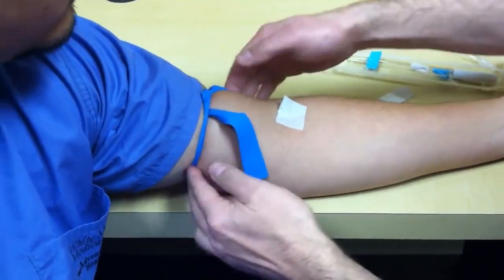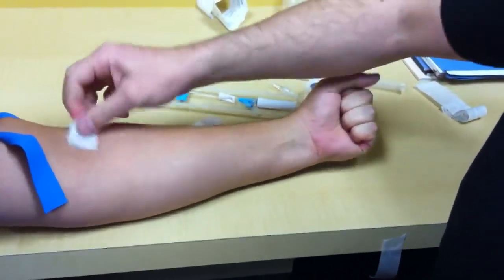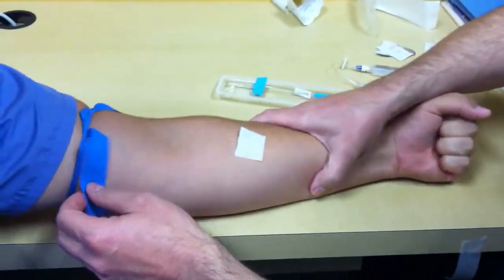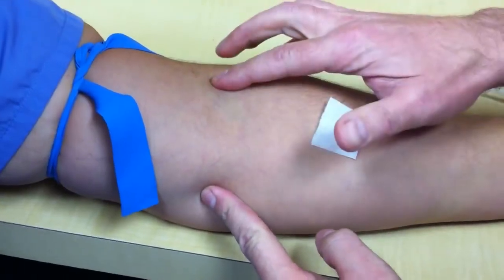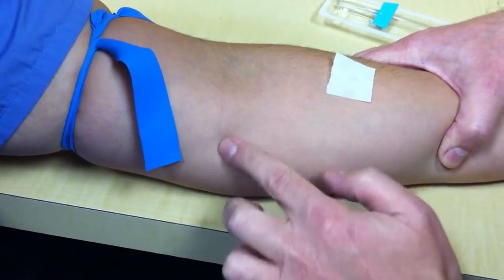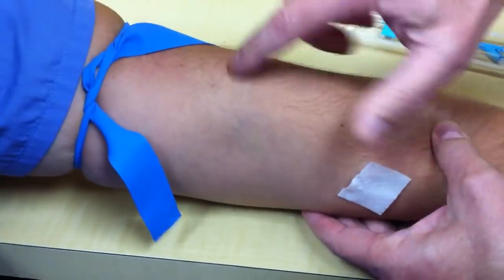Have the patient squeeze their hand like this. There's usually a vein — there's one of three possibilities. There's usually one here, one here, and one here. These are the locations. Not everybody has all three; they're going to have two out of the three. Some people you're going to find a nice one here, one here, or one right here.